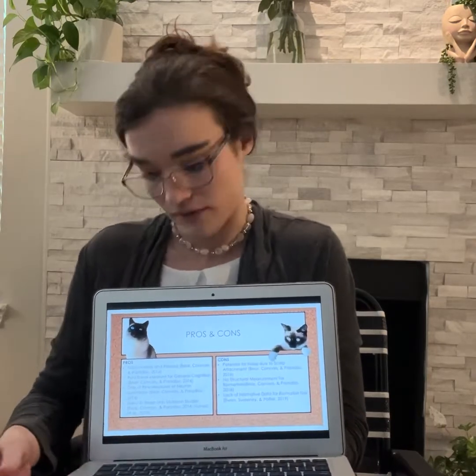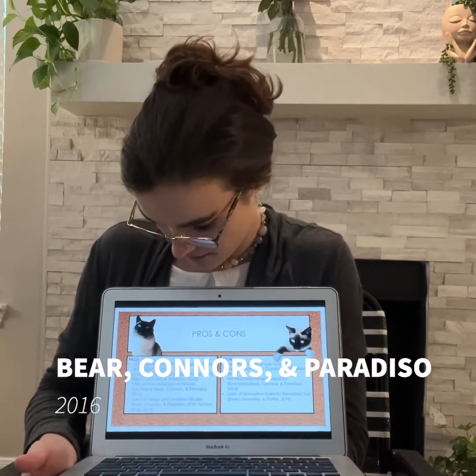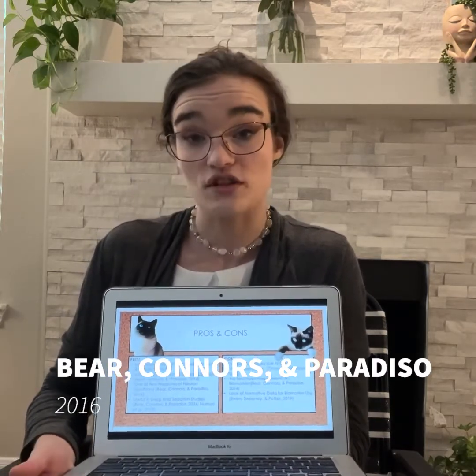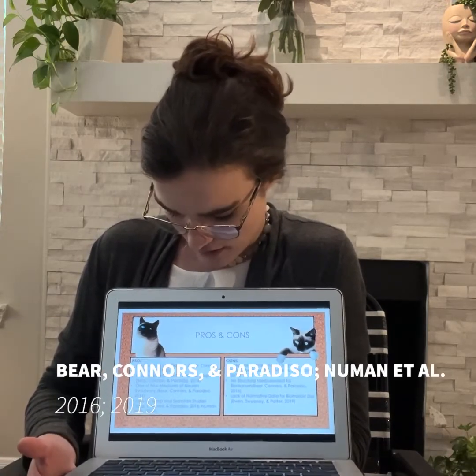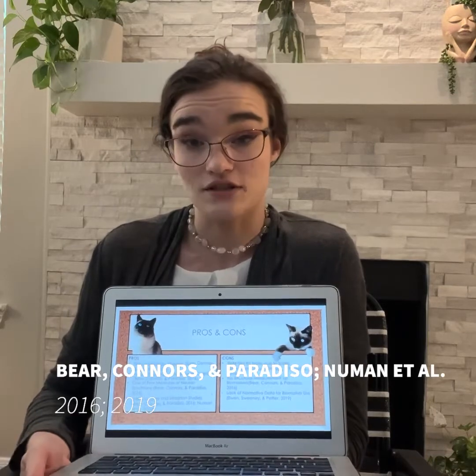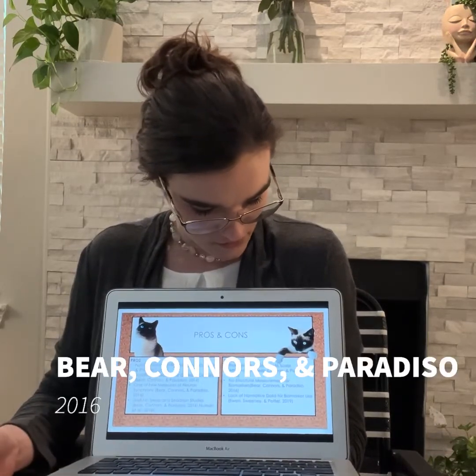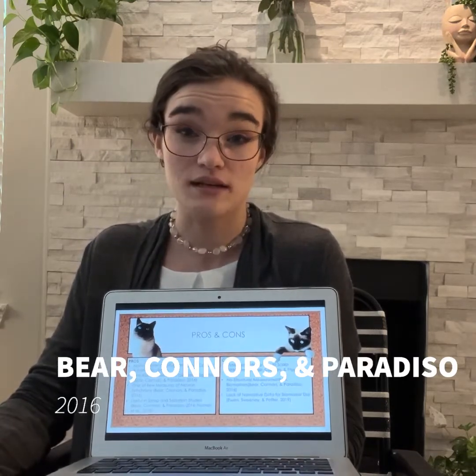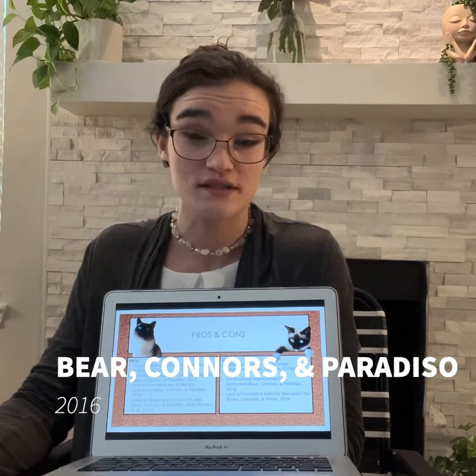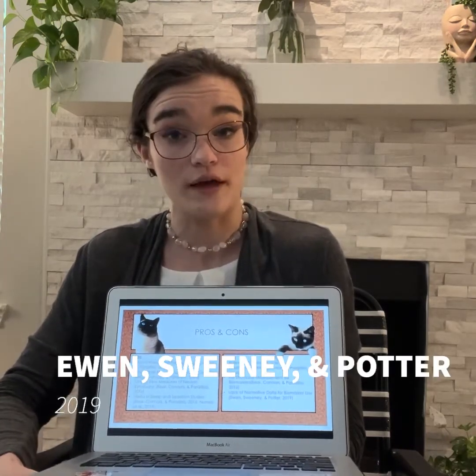There are big benefits. First of all, it is non-invasive and painless due to scalp attachment. It is a functional measure for general cognition. It is one of the few measures of neuron synchrony, and it is useful in sleep and sedation studies. Now for the cons. It has the potential for noise due to scalp attachment. There's not really any structural measurement other than assigning certain electrodes to certain regions. And there's a lack of normative data for biomarker use.